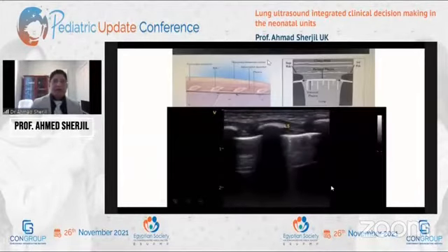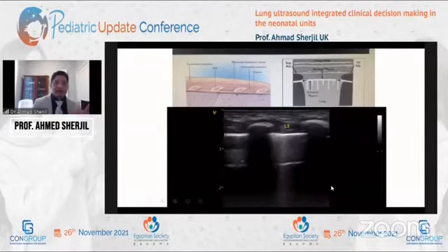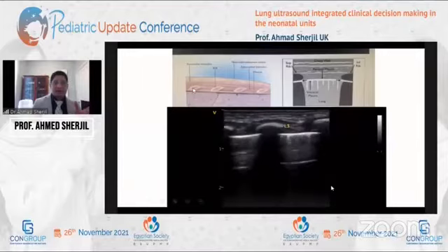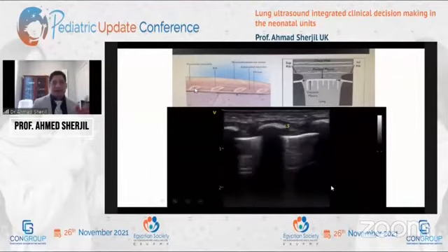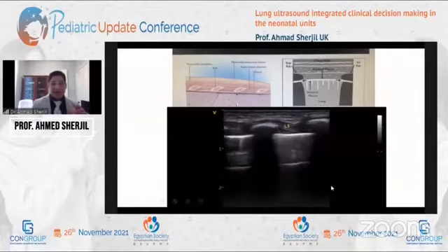So here is a comparison, if you can see my pointer. You're seeing a usual anatomy atlas photograph of the chest wall that shows the chest wall, the skin and the subcutaneous tissue. Then if you follow my arrow, ribs, and under the ribs is the lung parenchyma.